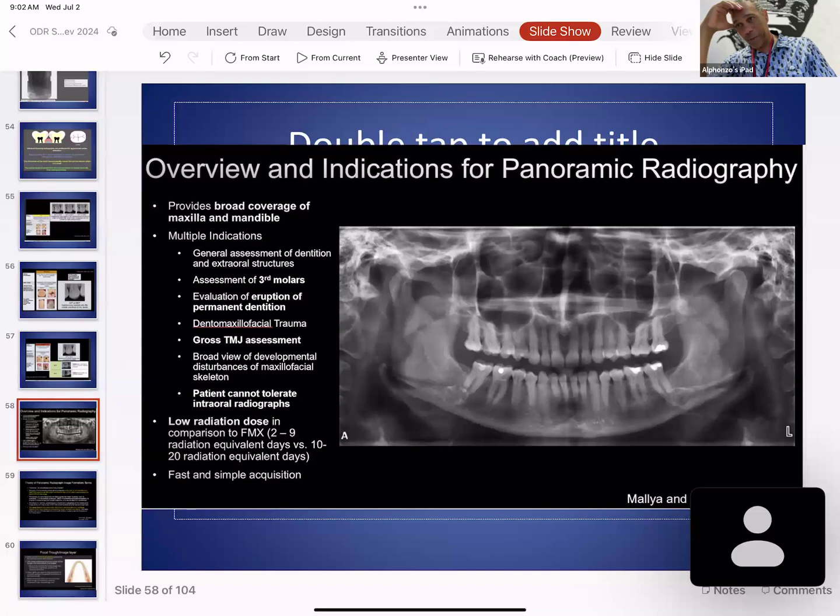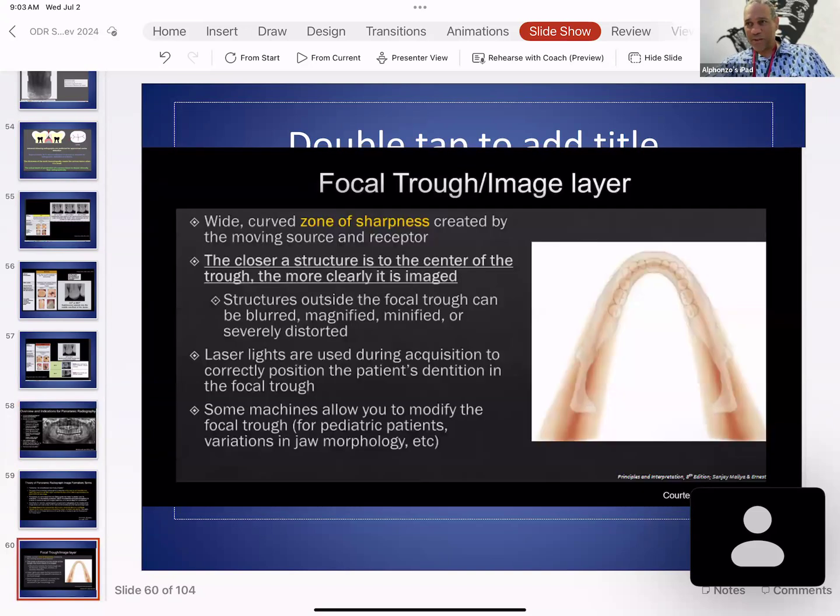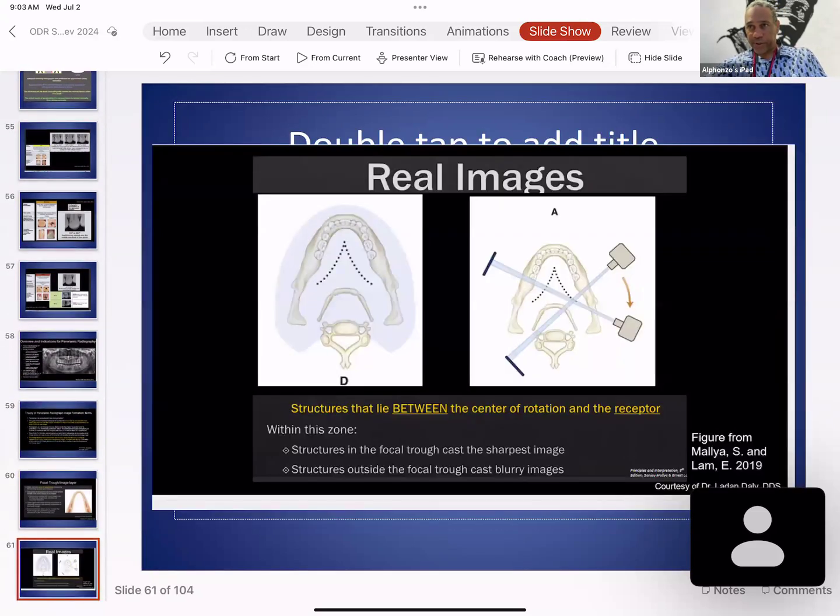Or if they get a really big smile, when the maxillary anterior teeth, the centrals, are further down or inferior, you can tell that the head is positioned in a downward position. And again, that's the Terminator smile, I call it. You ever watch that movie, Terminator, had that weird looking smile. So anyway, you pay attention to those things.